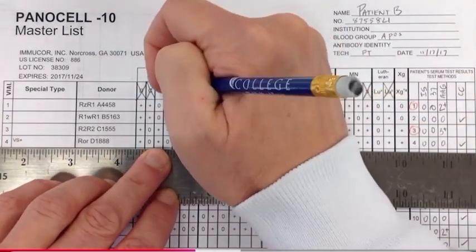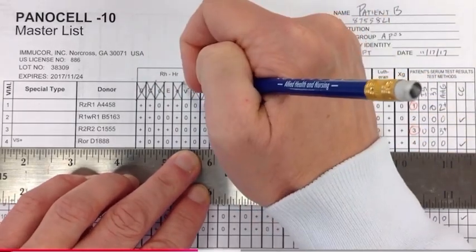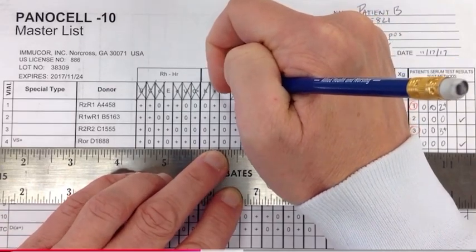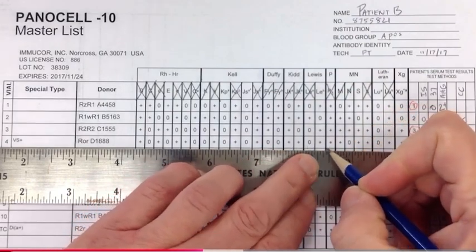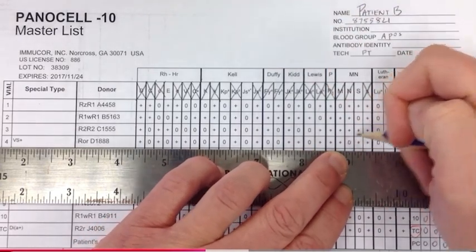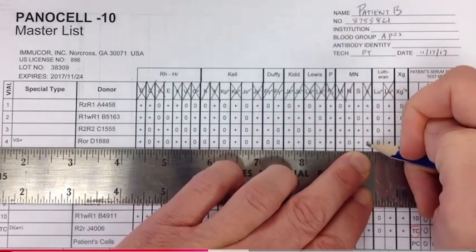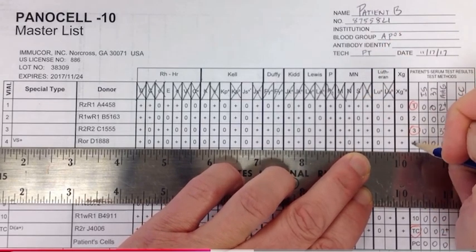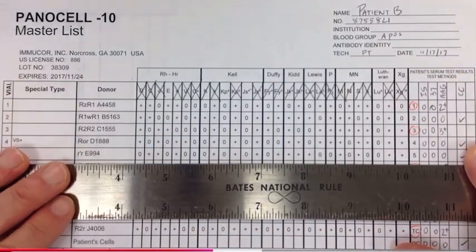Okay, now we have little c, homozygous. Let's rule it out. V, it's by itself. We're going to rule that out. Okay, small k, it's homozygous, so we're going to rule that out. Okay, Lewis B, homozygous. Okay, now we have big M, homozygous, so now we can rule that out. Okay, now big S is heterozygous, so let's give it 1 slash. And XG here is by itself. Let's go ahead and rule that out.